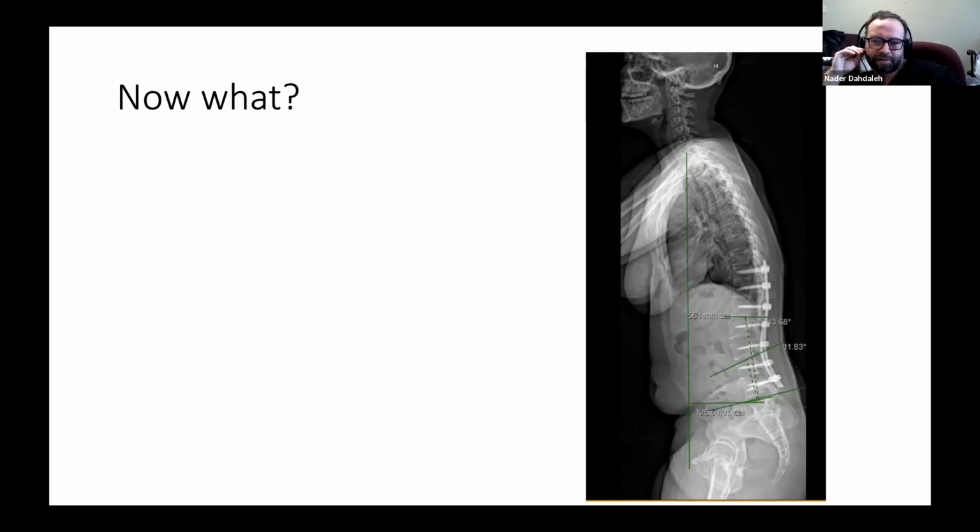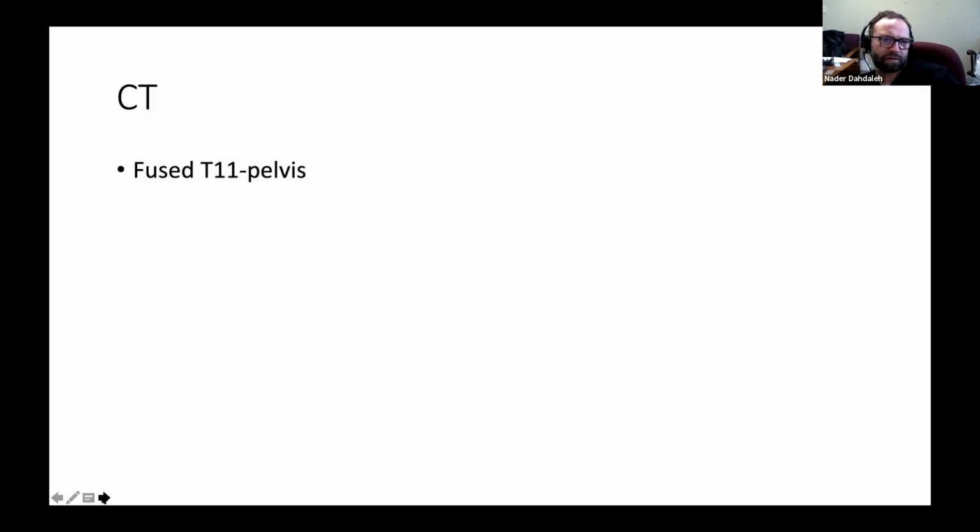Great case, Matt. The good news is you have that L5-S1 disc that you can take advantage of, because did she heal, you would think, across those segments? I mean, it's 9 months. Did you get a solid fusion there? Yeah, good question. Yeah, so she fused through everything, of course.